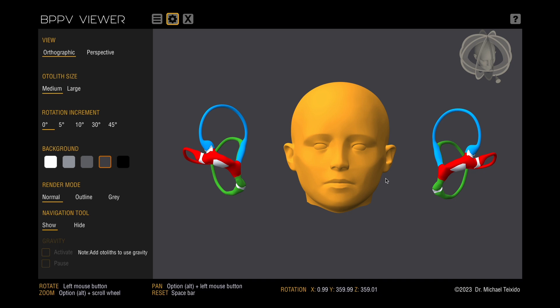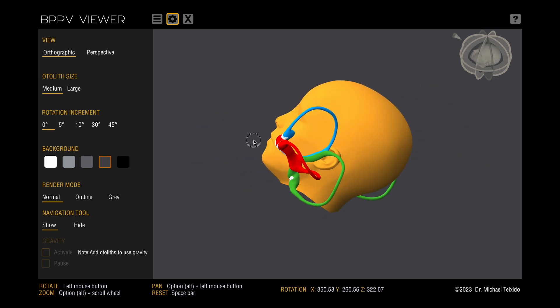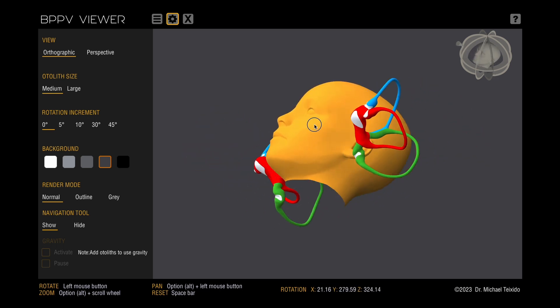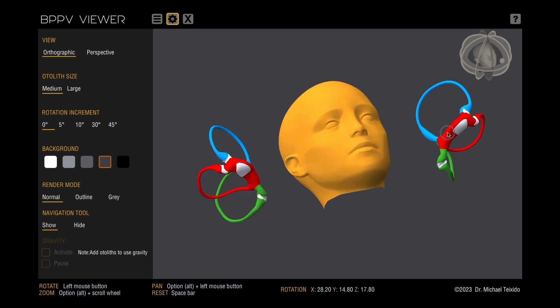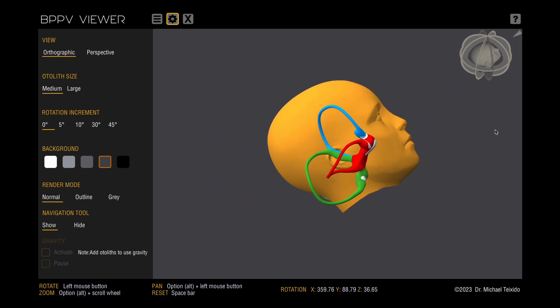Let's begin with navigation. You can operate the tool using either a mouse or a trackpad. To rotate the model, simply click and drag.